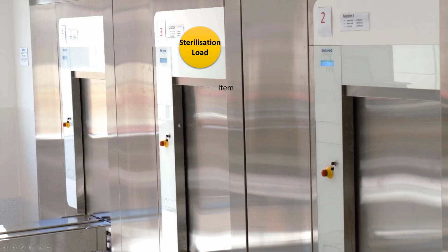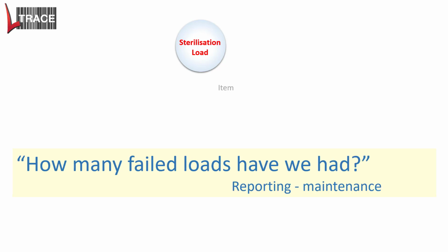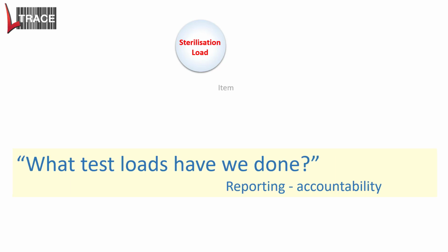Now let's introduce the concept of a sterilisation load. Now we can answer questions like how many loads have we done, which is fantastic for your annual, your monthly reporting. How many failed loads have we had? What test loads have we done? At this stage, most of those just help the manager, but really it's just taking those results and putting them in a computer so you can quickly know what's going on.